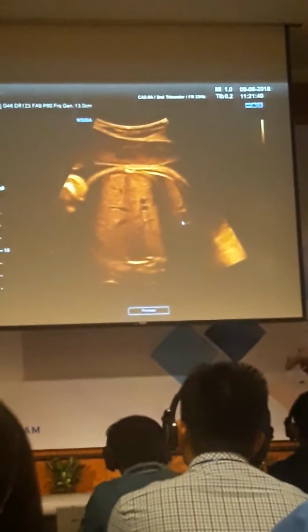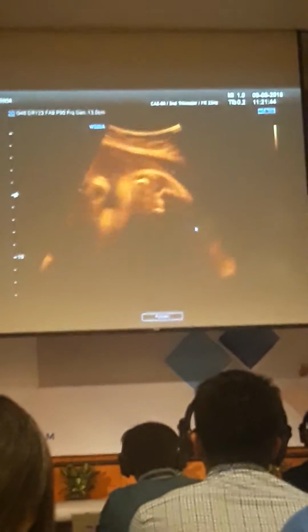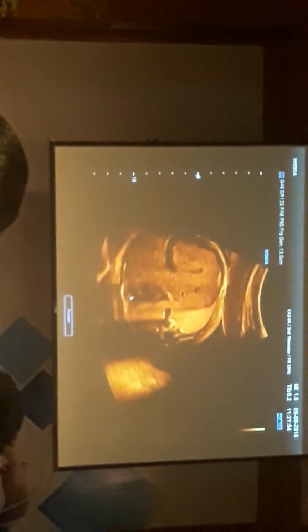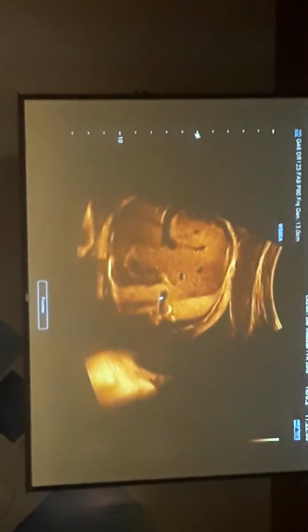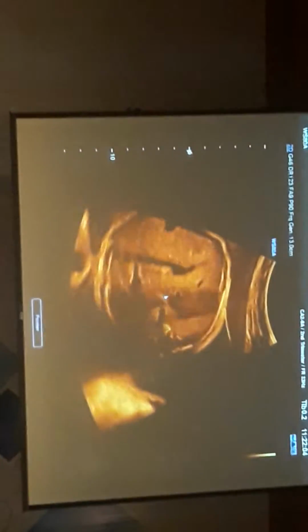this is the spine, of course. Head is down. So this must be the fetal left. So it seems like the stomach is on the left. Descending aorta, IVC. So all that looks normal.